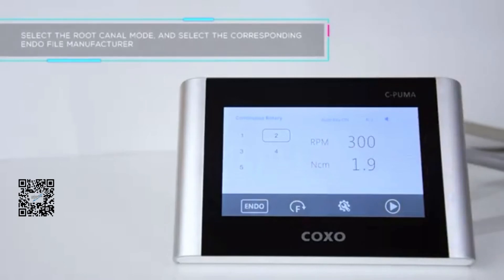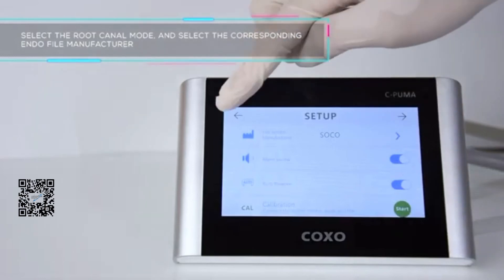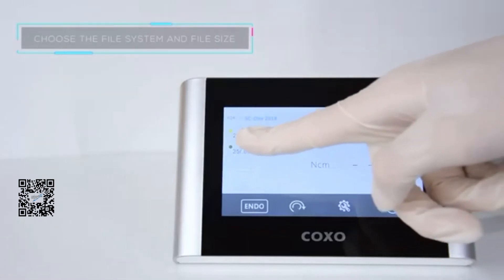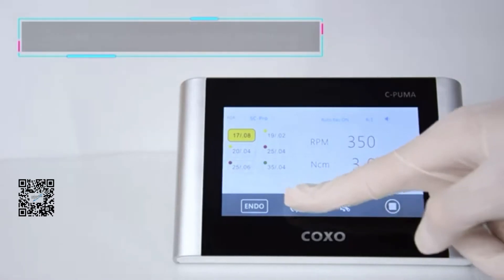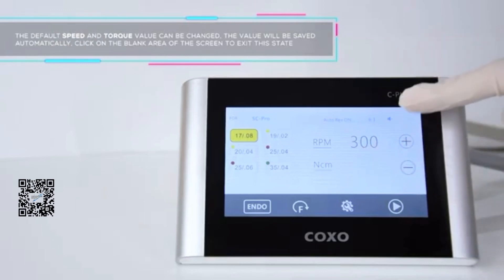Select the endomotor mode and select the corresponding endomotor brand. Choose the file system and file size. Long press the start button to start the motor. The default speed and torque value can be changed, and the value will be saved automatically. Click on a blank area of the screen to exit this state.